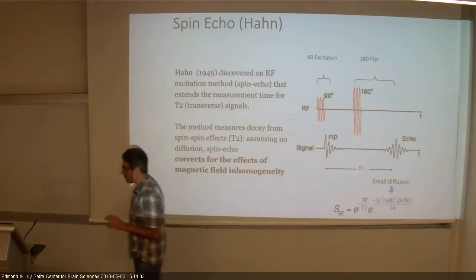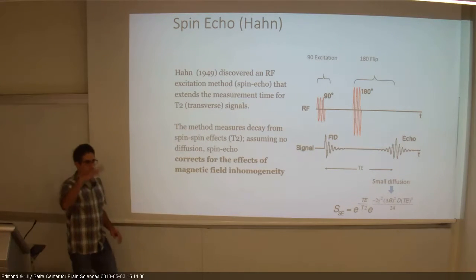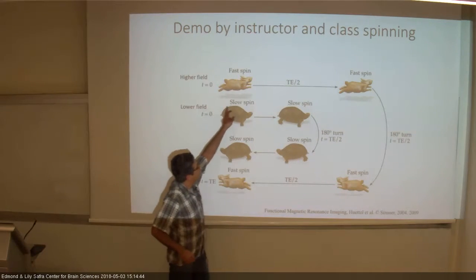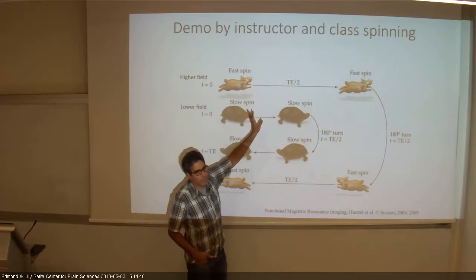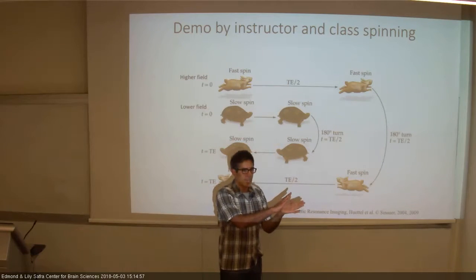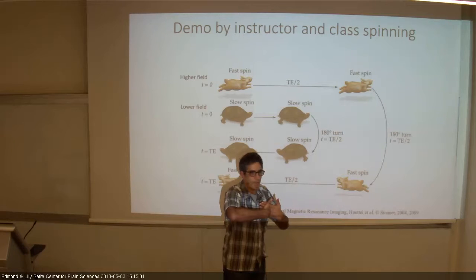I will try to explain what's going on now. What is the intuition of what's happening here? There was a 90, and what was happening is that things start to get off. There were different spins, each of them getting off, if you're on a frequency a little bit off, and that's where we got dephasing, right? Then he pushed them to flip them to the other side.